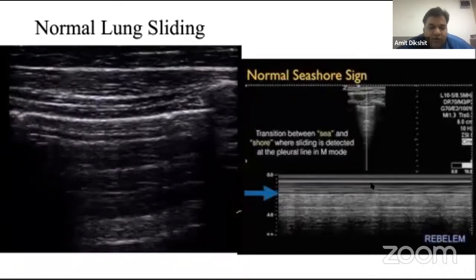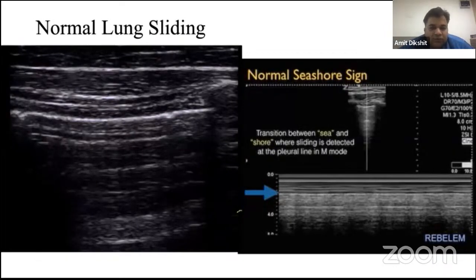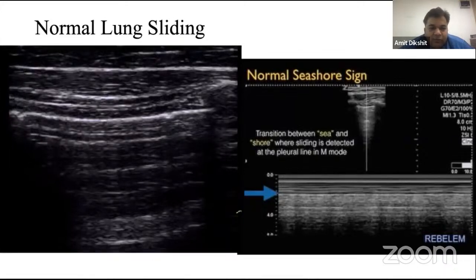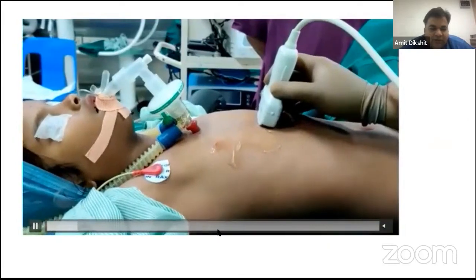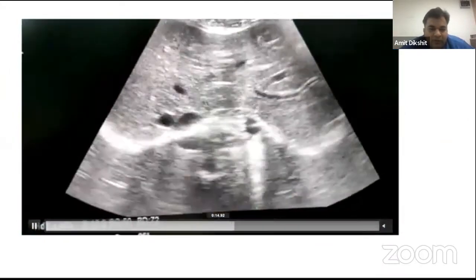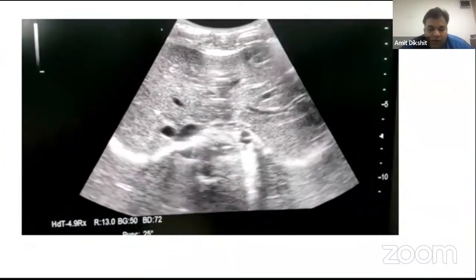Now, this is useful when we are doing DLT, though the gold standard for DLT is definitely pediatric fiberoptic intubation, using the pediatric fiberoptic scope to see the blue cuff and everything. But for this technique, there was a paper from Tata Memorial Hospital, Mumbai, by Dr. Jiggy Diwati and group, where they proved that it is better than auscultation. So ultrasound is superior to auscultatory methods, and you can see whether it has become endobronchial or not just by placing the probe. In the pediatric population there is another advantage: because the sternum is not calcified, you can even see the movement of the diaphragm very well. Nowadays, with most machines you can change the probe with a click of a button, see whether it is moving or not, and confirm.